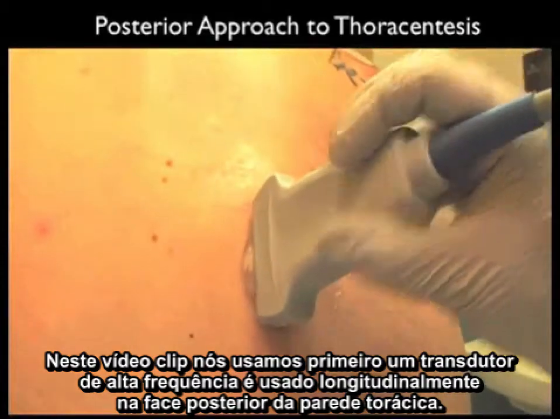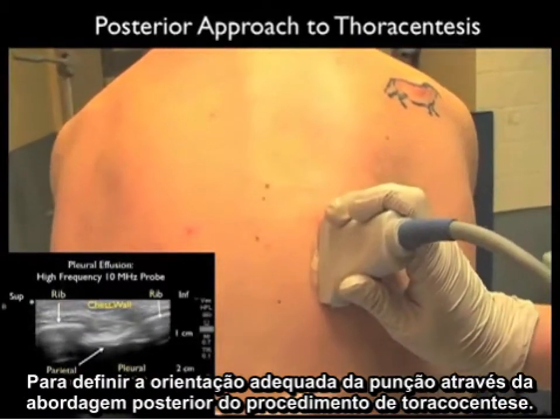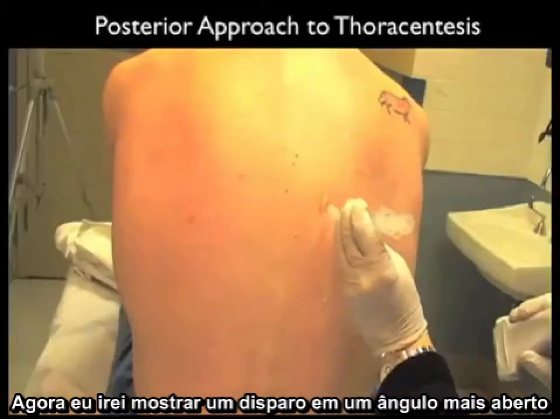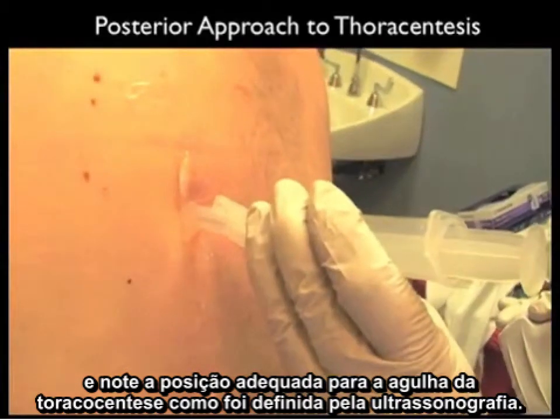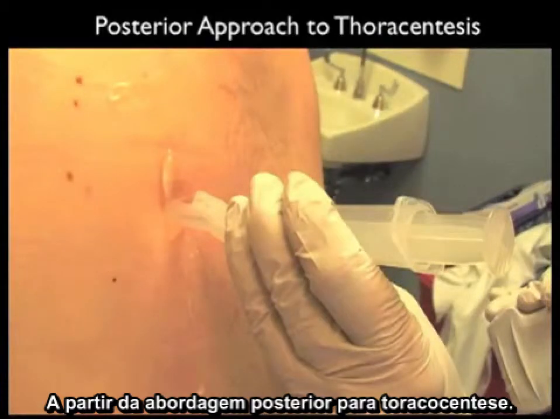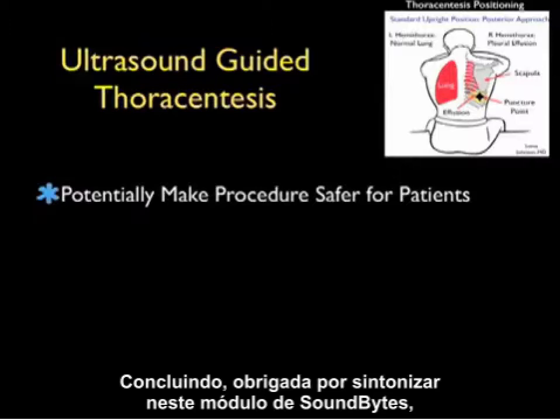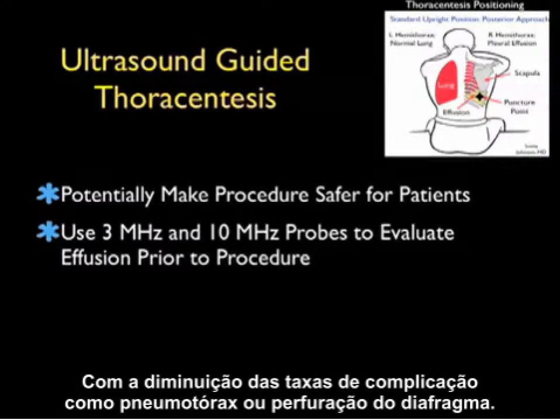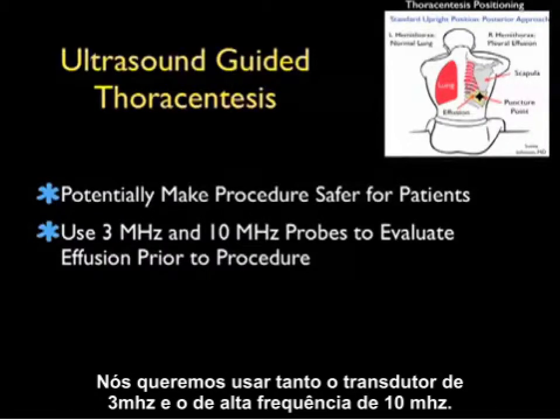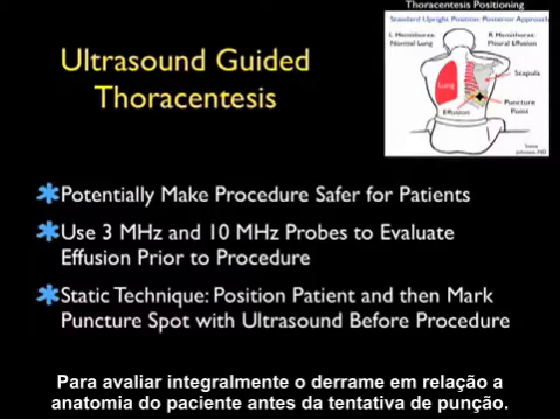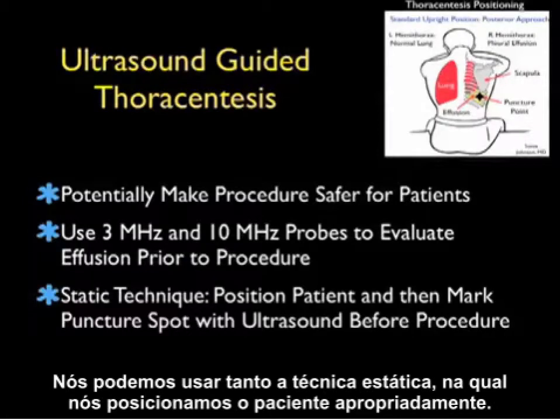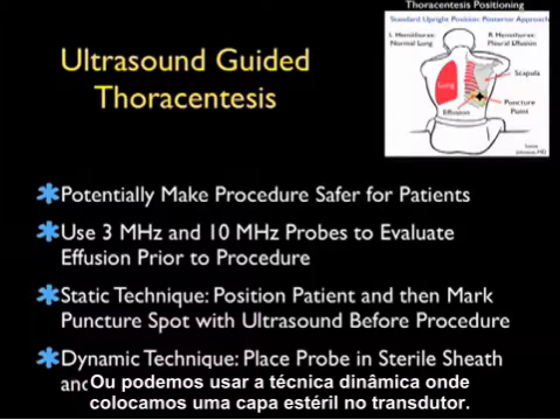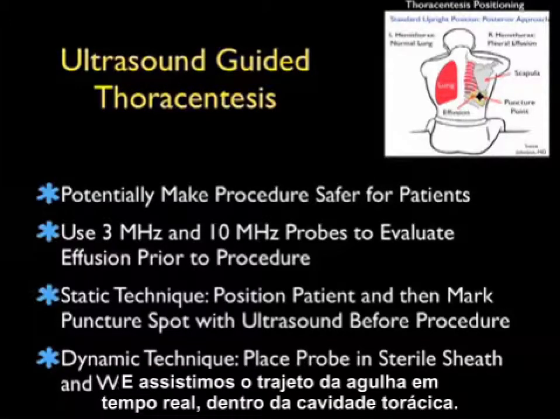In this video clip, we'll place the high-frequency 10 megahertz probe along the posterior aspect of the chest wall to define the proper orientation for the puncture in the posterior approach to thoracentesis. The needle can then come in directly underneath the probe. This is the proper position for the thoracentesis needle as defined by sonography from the posterior approach. In conclusion, sonography can potentially make the procedure safer for our patients with a decrease in complications such as pneumothorax or perforation of the diaphragm. We use both the 3 megahertz and 10 megahertz probes to fully evaluate the effusion in relation to the patient's anatomy. We can use a static technique — marking the puncture spot prior to the procedure — or a dynamic technique, placing the probe in a sterile sheath and watching the needle in real time enter the chest cavity.